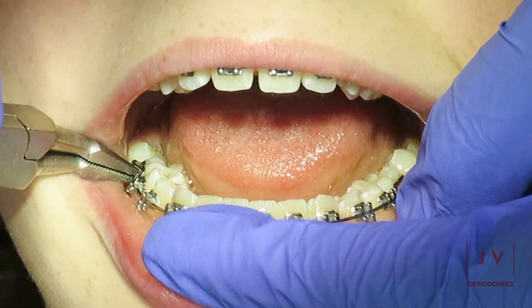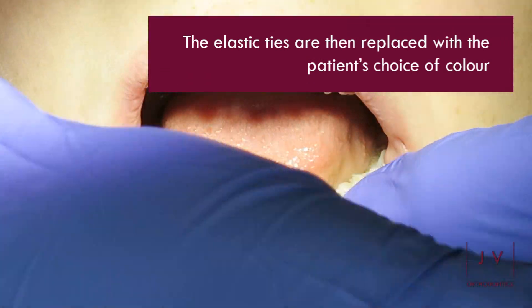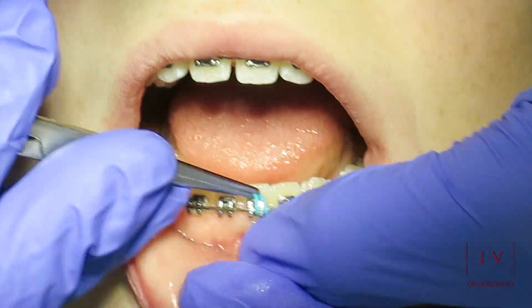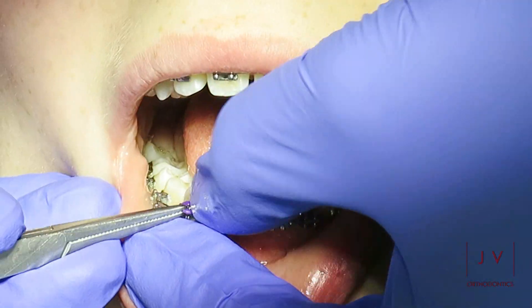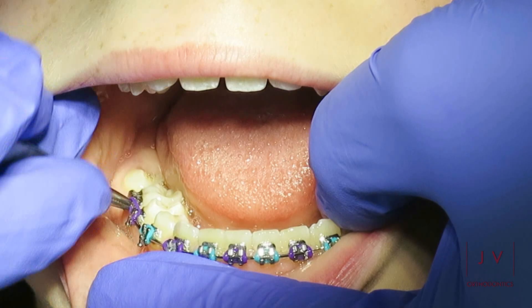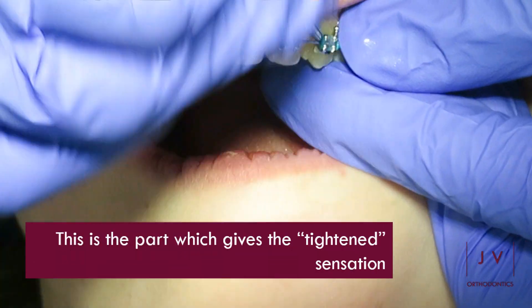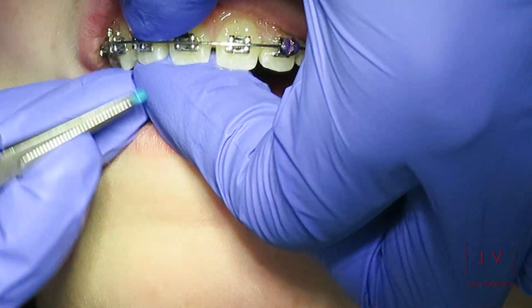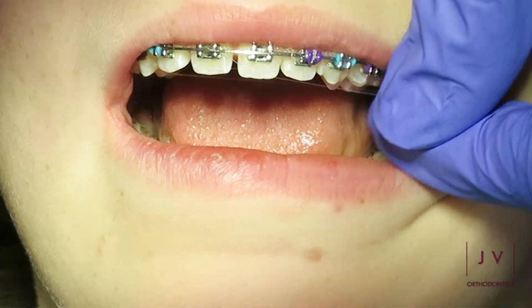Once the wires have been placed back into the brace, we then secure the wires into position using the elastic ties, and these are usually the patient's choice of colour. This part is what usually gives rise to the tightening sensation because these elastics are very tight. The risk of using weak elastics here is that the wire then doesn't engage into the brace tight enough and therefore the teeth don't move as we want them to.